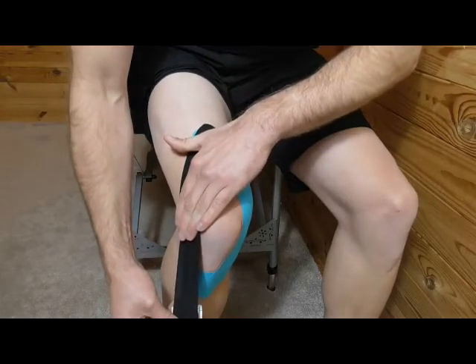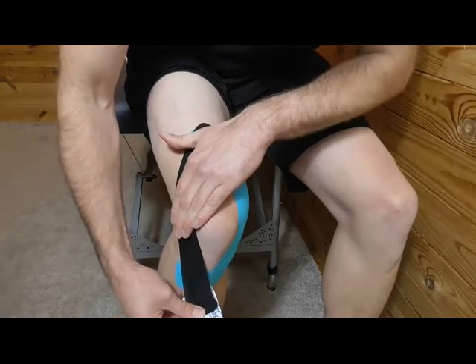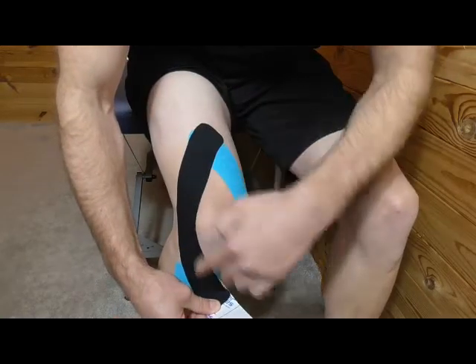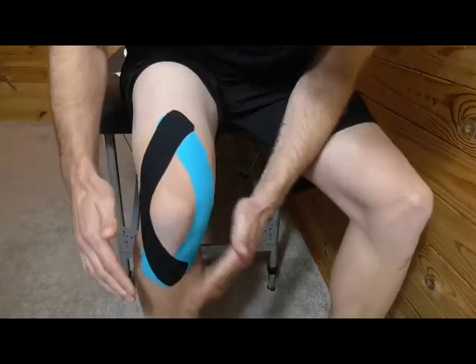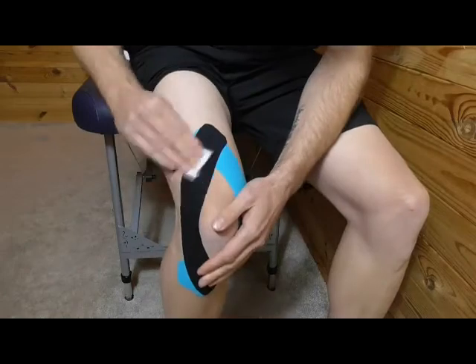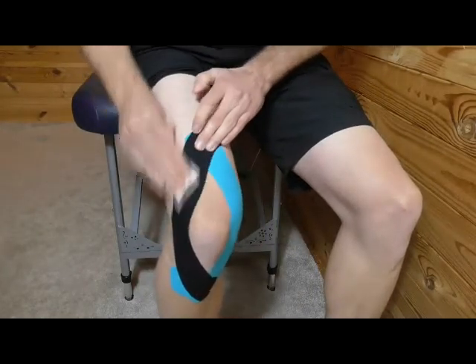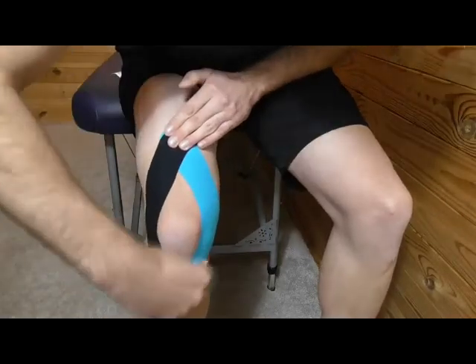Apply about 25% stretch to the outside of the knee, then pin it and go to 100%, back off to 50%, so there's slightly more stretch as you go around the outside of the knee. Then place that down onto the tibial tuberosity and give it a rub to warm the glue up.